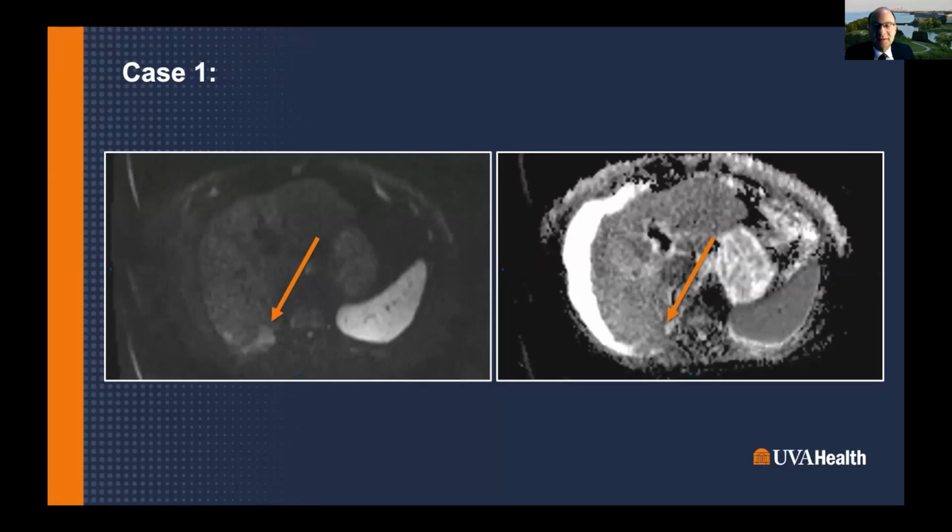Yeah. Does that mean the ADC went lower or the ADC went higher? Because in my experience, usually when it's getting smaller, it's usually responding. And I guess my other question is, can you tell if it's the area that was treated, or if there was an adjacent area with a different blood supply? Because what you're describing, to me at least, sounds like usually if it gets smaller, in my opinion, the whole area responded.